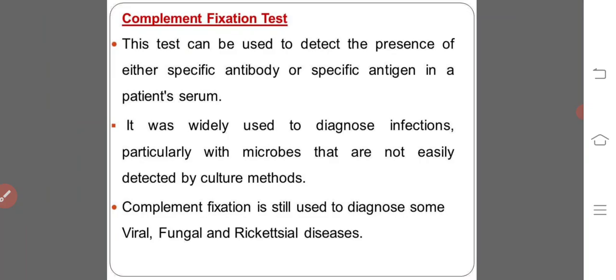It requires a veritable zoo of reagents and numerous preparatory steps. There are almost as many versions as there have been users. The microtiter version developed at the Center for Disease Control and Prevention includes rigorous controls and is commonly used.